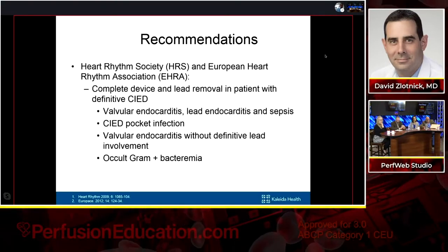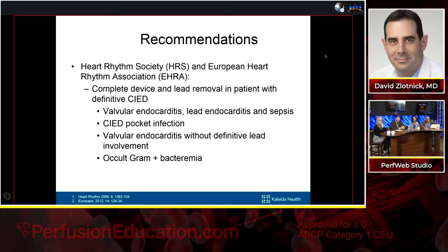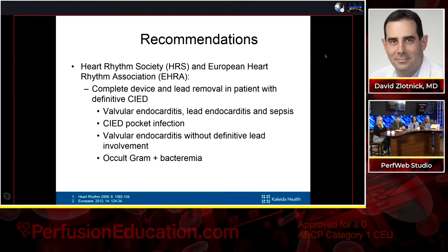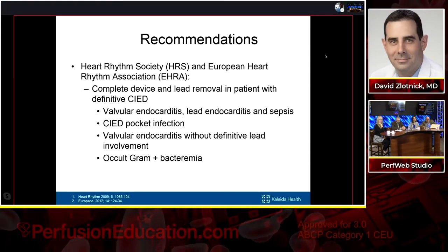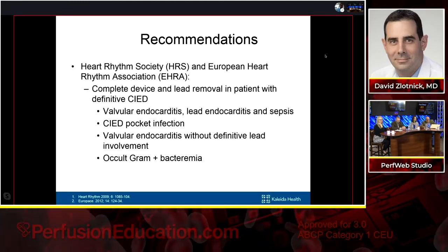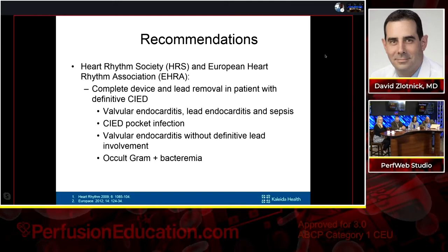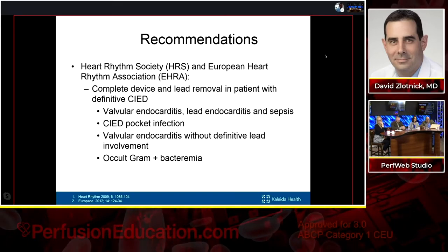The Heart Rhythm Society and the European Heart Rhythm Association recommend complete device and lead removal in patients with definitive cardiac implantable device infections if they have valvular endocarditis, lead endocarditis, and sepsis, if they have a pocket infection, if they have valvular endocarditis even if there's no definitive evidence of lead involvement, or if there's an occult gram-positive bacteremia that we can identify.